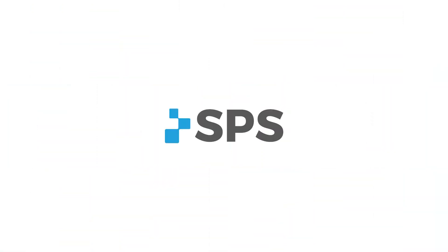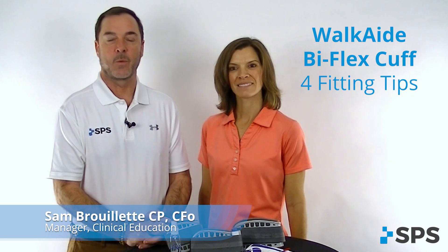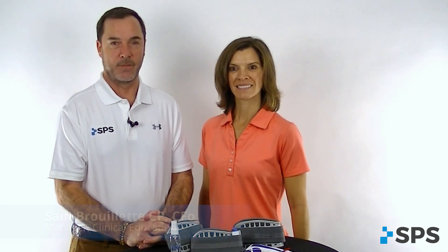Hi, I'm Sam with SPS. Welcome to the Clinical Minute. Today I'm joined by Jody, and in this segment we're going to look at WalkAid Bi-Flex Cuff Fitting.